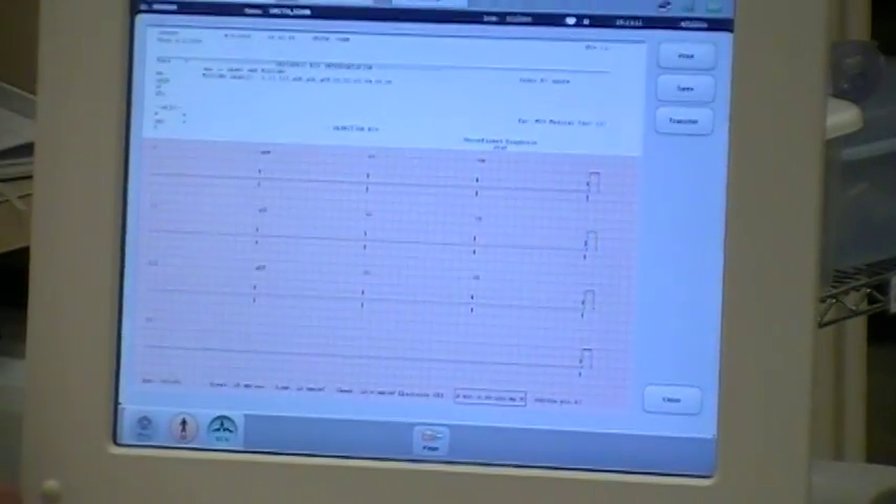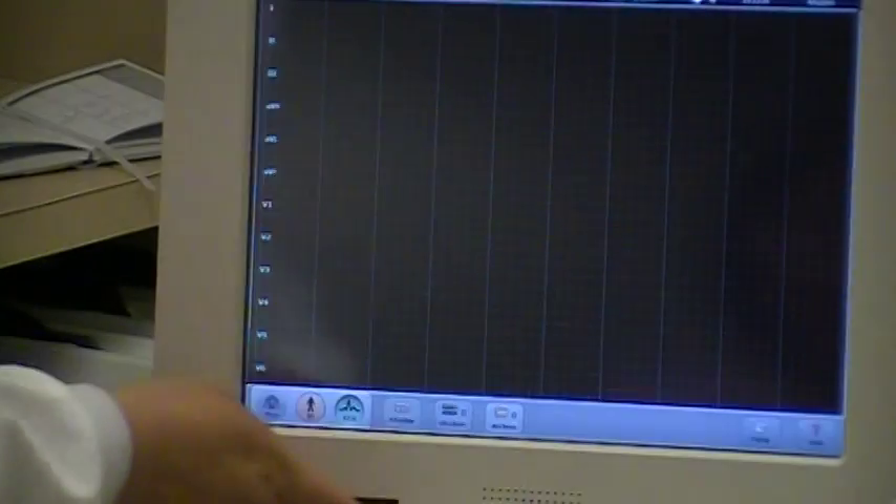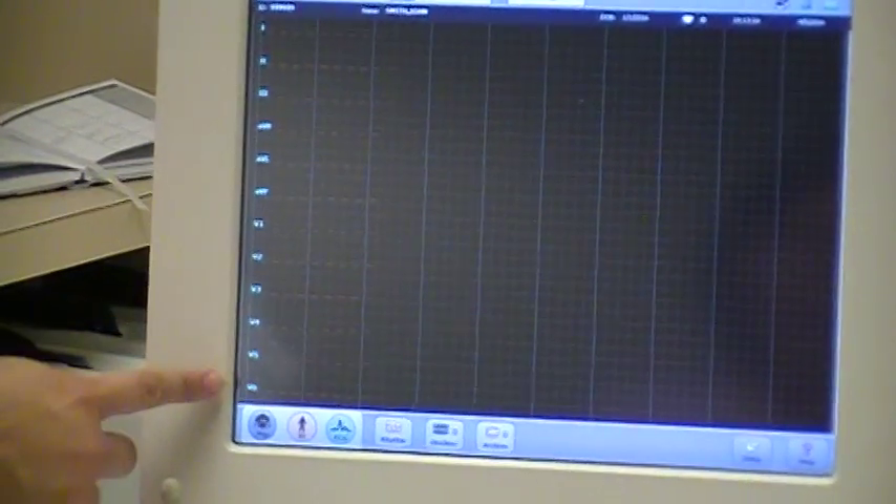You want to wait until all areas of the EKG are visible on the screen. If you have a red line on your screen, the red dotted line indicates that the lead is not connected.